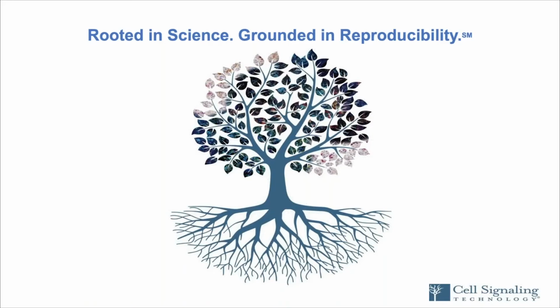I will say you're more likely to see differences in signal strength between different diluents than you are localization. There may have been 1 or 2 cases in the thousands of antibodies we've looked at that the localization may be affected by the diluent, but I would say it's quite unlikely that you would see that.